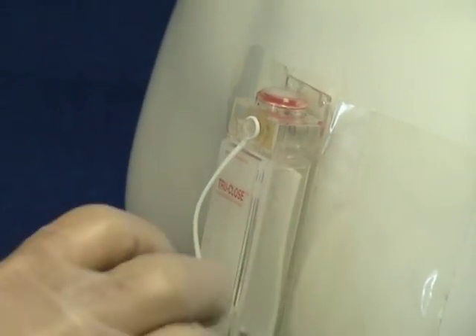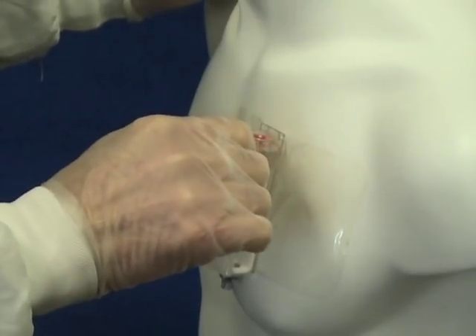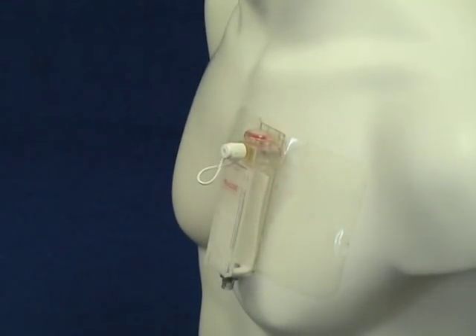If the vent is to be left in place for further therapy, then the self-sealing port must be covered with the tethered cap after removing the occlusion plug.